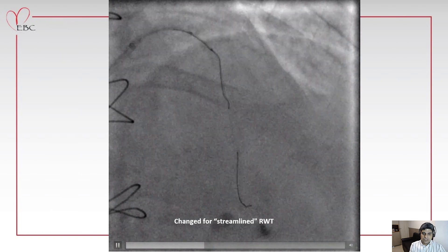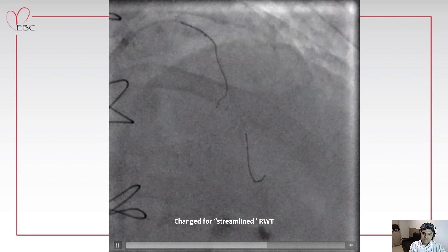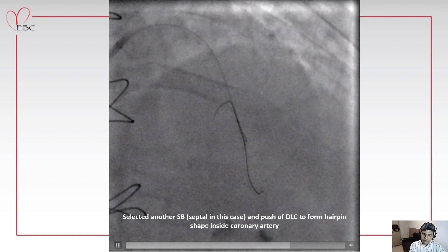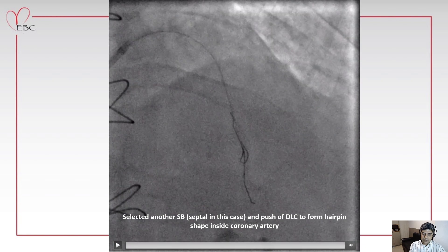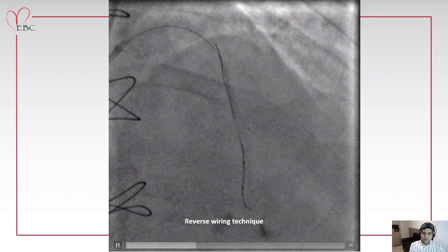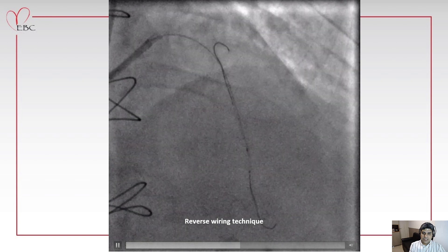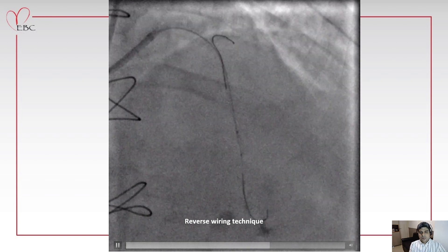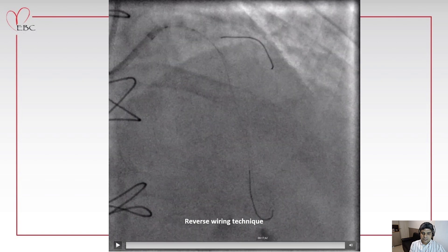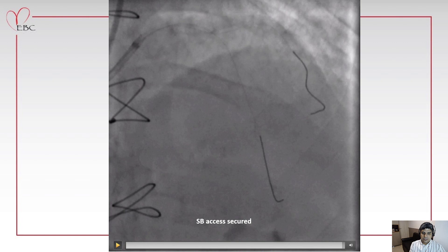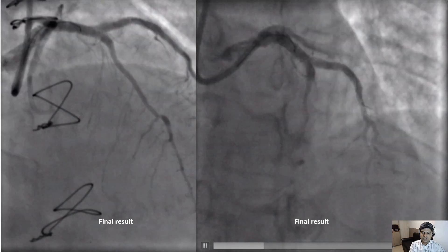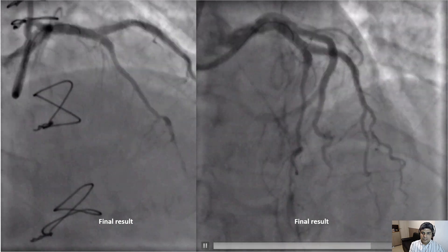We changed to the streamlined reverse wiring technique, which consists of selecting a distal side branch — in this case a septal branch — and pushing the double-lumen catheter to form the hairpin-shaped wire inside the coronary. With gentle pullback movements of the double-lumen catheter, we engaged the side branch ostium in reverse fashion and proceeded with the reverse wiring technique. With gentle movements, the wire entered the side branch. The side branch was then secured, and we proceeded with the full stenting technique — in this case a DK crush — with IVUS optimization, achieving a very nice final result.